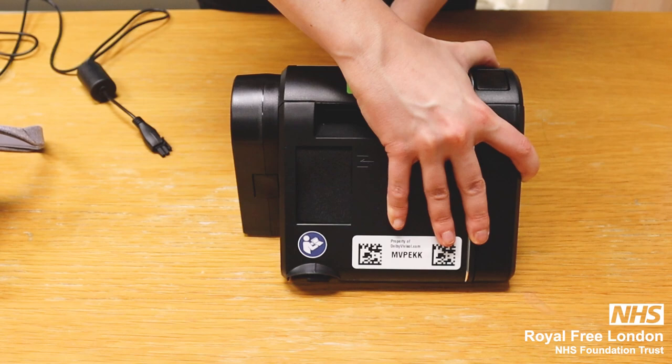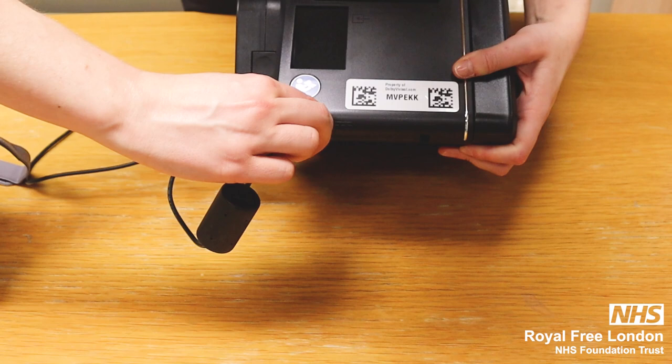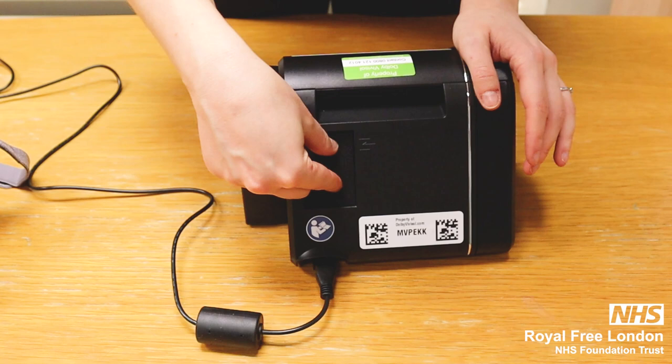At the back of the device you connect the power cable, which is connected to the mains, and you connect it like this.